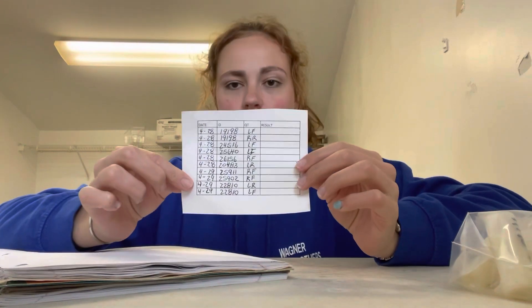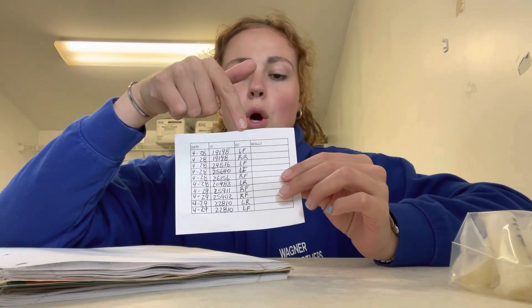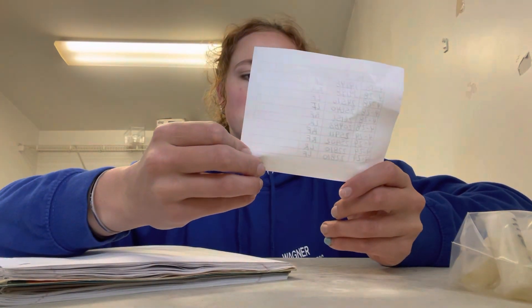The first thing I like to do is take my notebook where I keep all the records, and I write down each cow's number in the notebook, and then this code — so LF would be left front quarter of the udder, so like her left front teat, RR is right rear, and that just basically tells the herdsman which section of the udder the mastitis is in. So I'm going to write that all into my notebook.